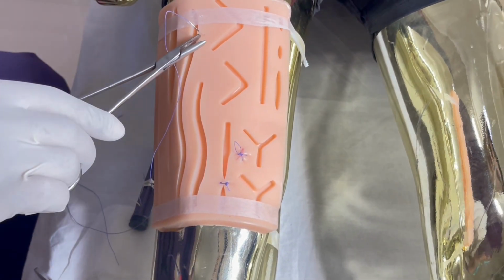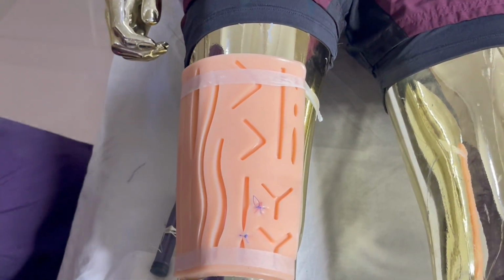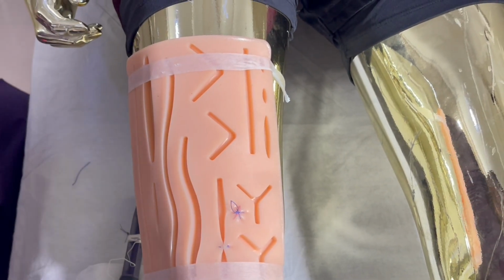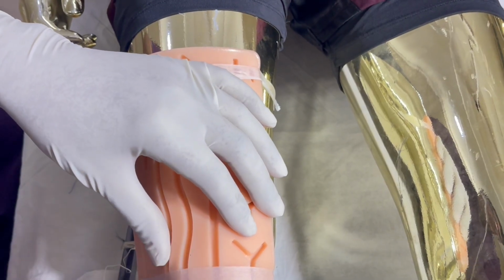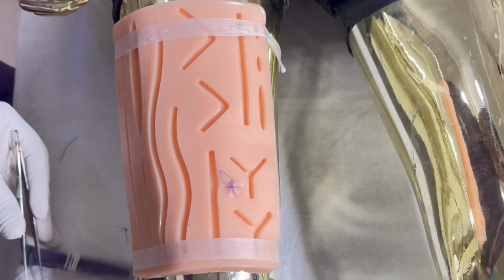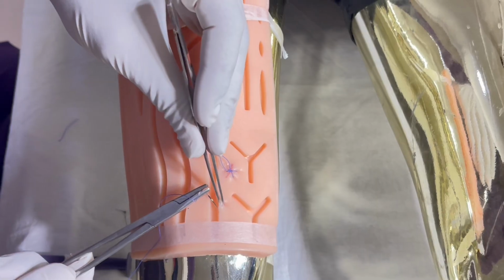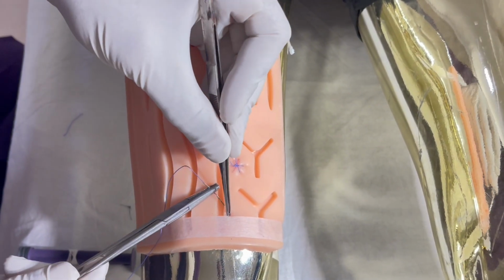The other station can be taking a subcuticular stitch. Suppose I have to start taking a subcuticular stitch in this. What I will do, first I have to make the first stitch at the corner, inside.